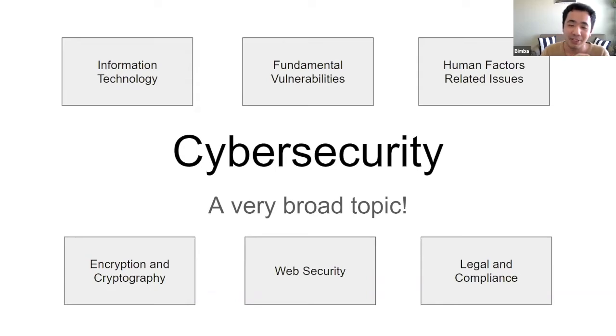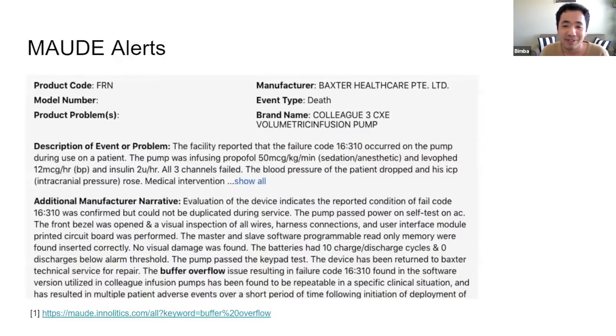Yeah, so we'll get into all of that, but just to put a little bit more meat on how dangerous some of this stuff can be. I came across the MAUDE database, and for anybody that doesn't know, MAUDE is this database of incidents that happen with medical devices. If something happens with a patient and the doctor is using a medical device, they're obligated to report it here so that we can learn from it and track it. But I found this on the MAUDE alerts page.